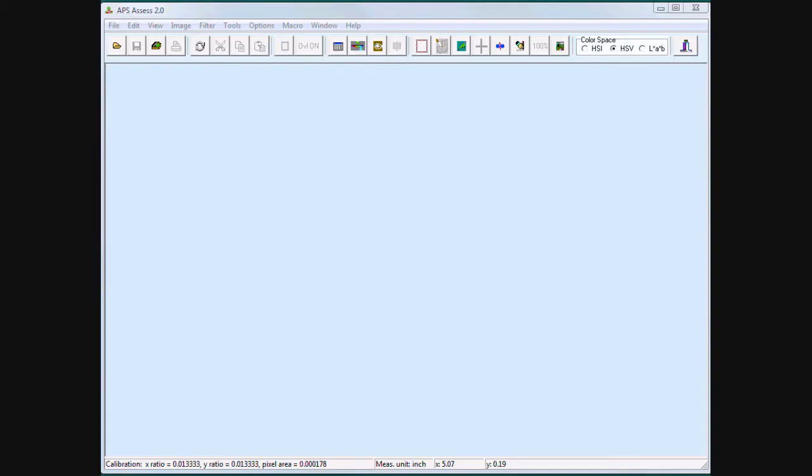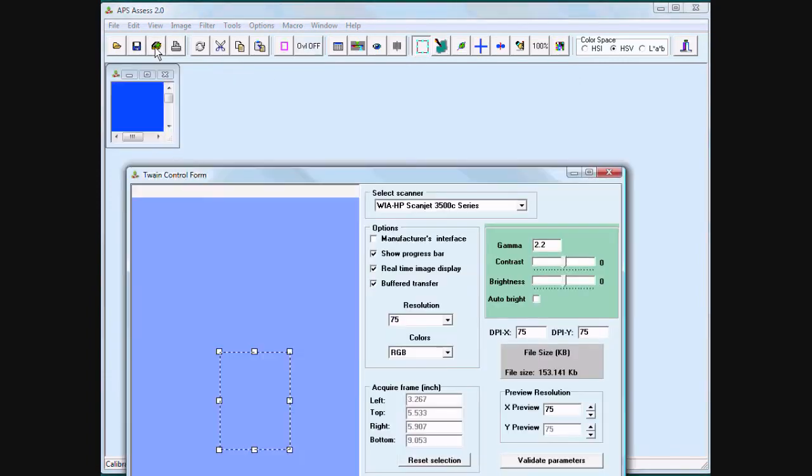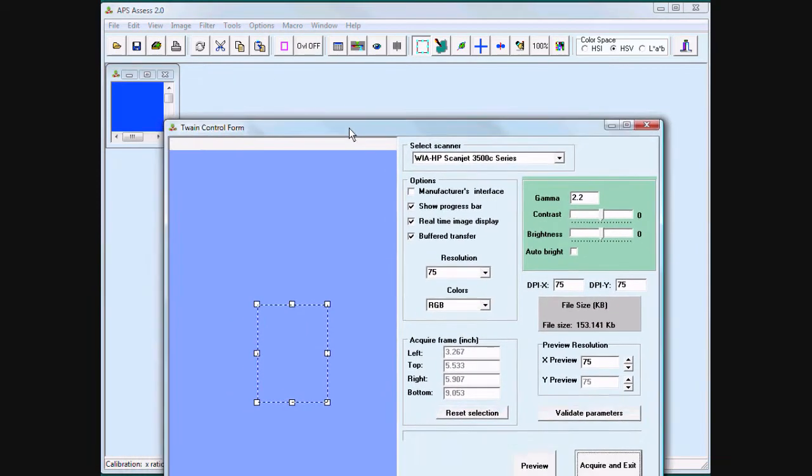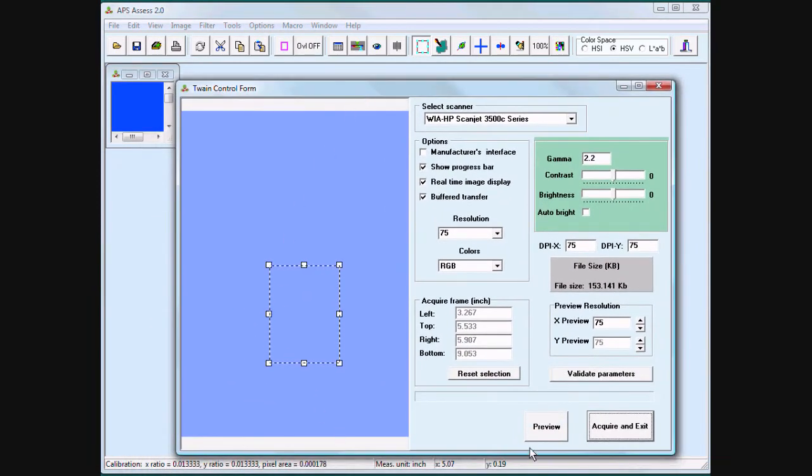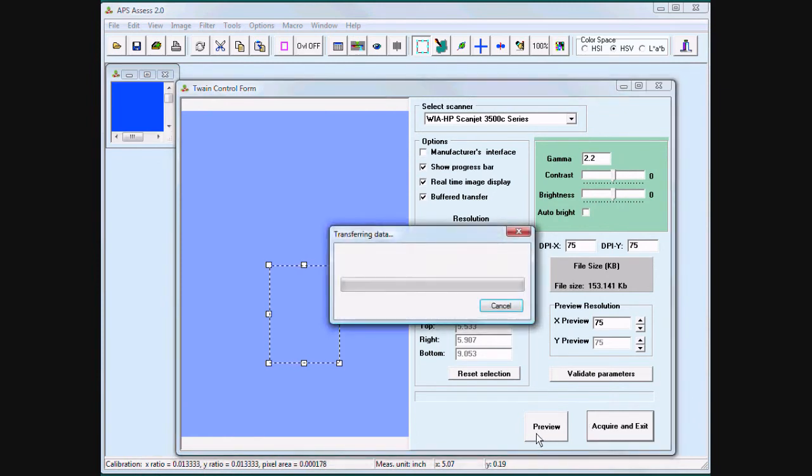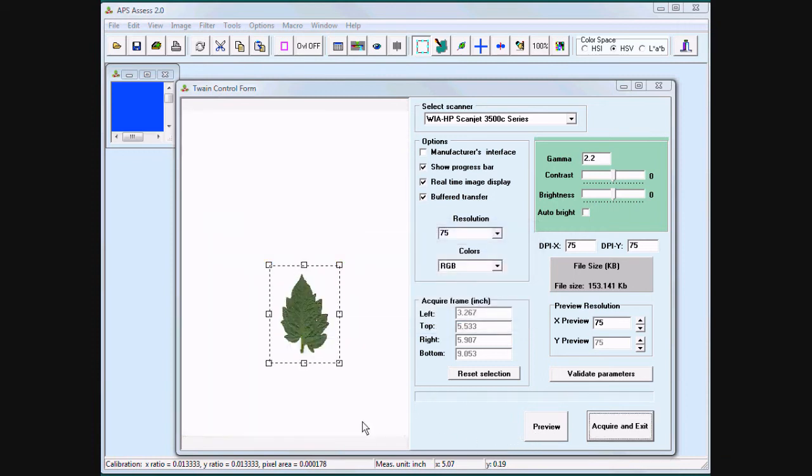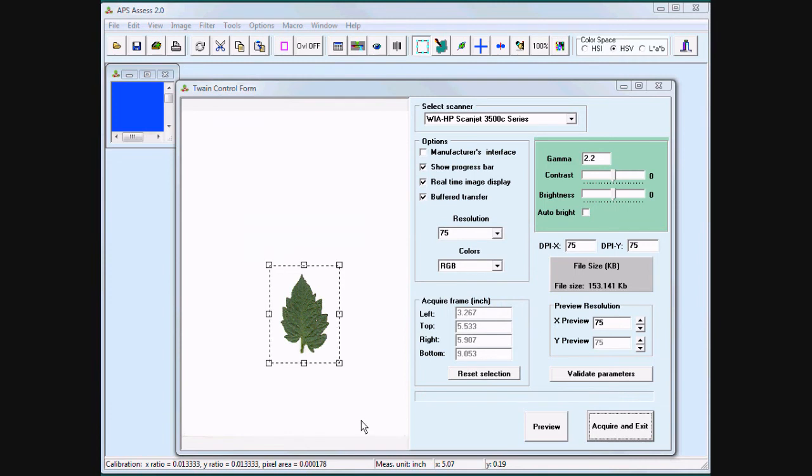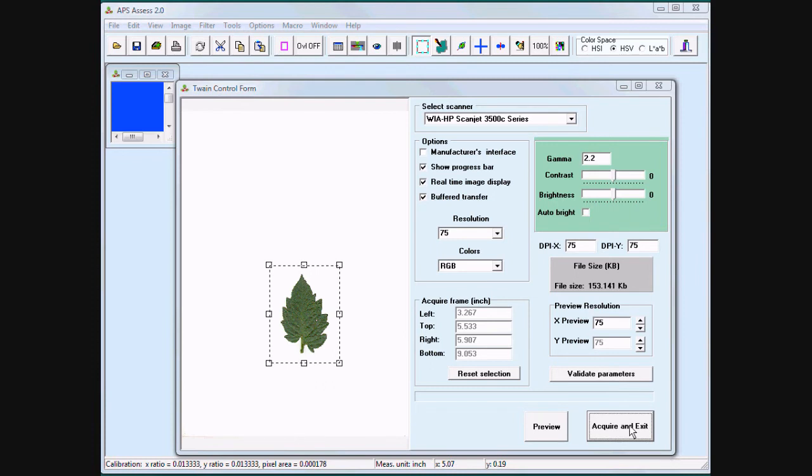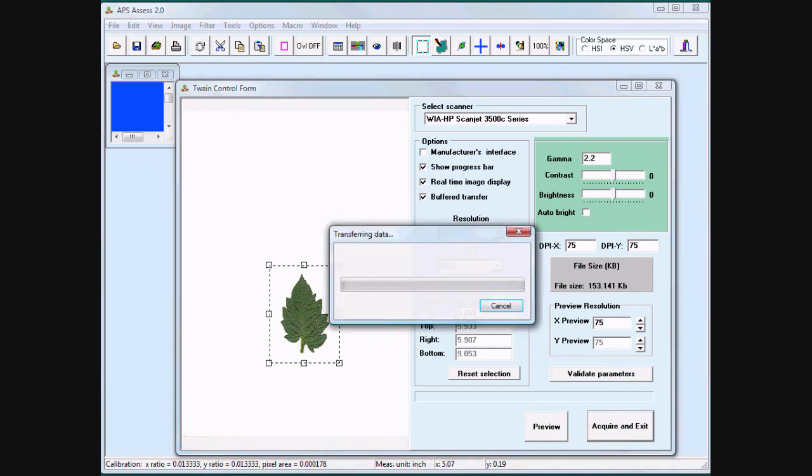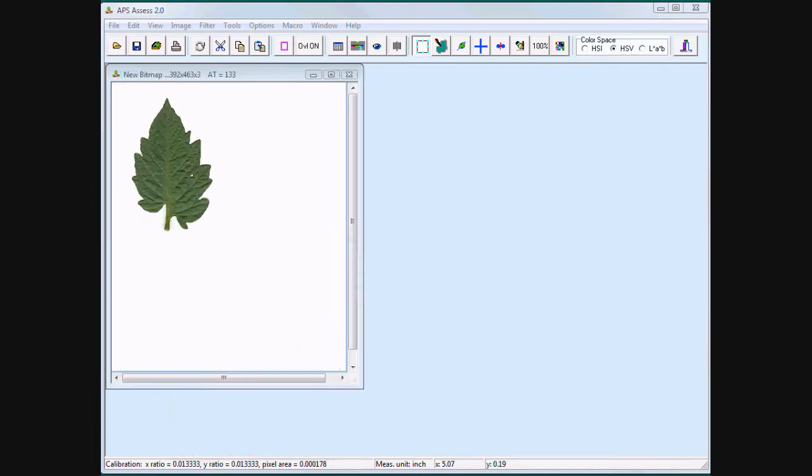Assess can acquire images directly through the TWAIN interface. When scanning with Assess, there's no need to calibrate. Assess already knows the size of the image.